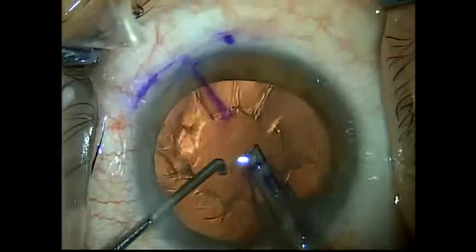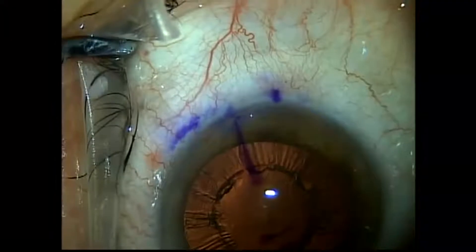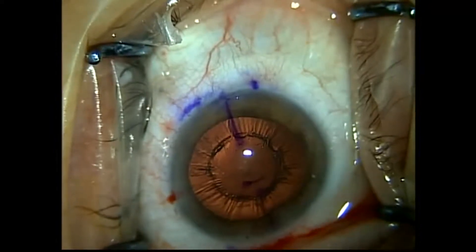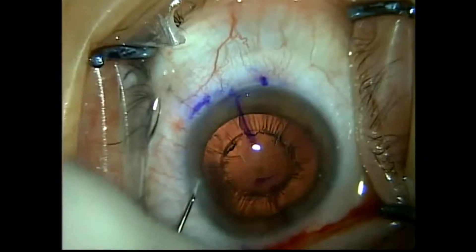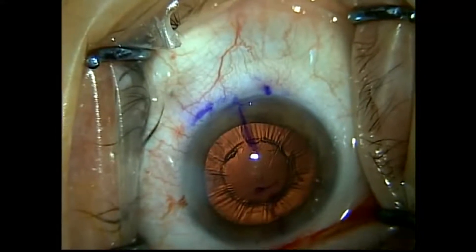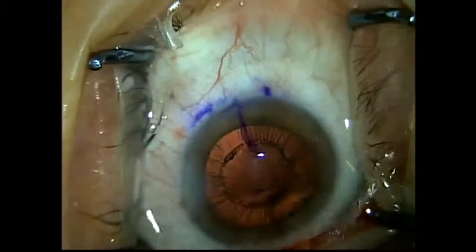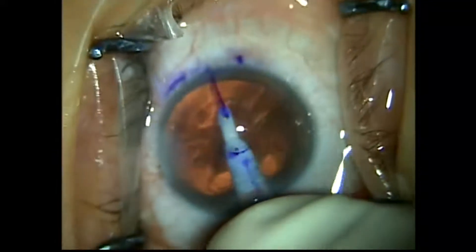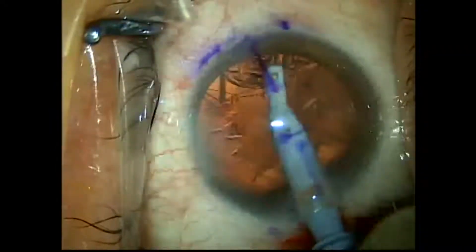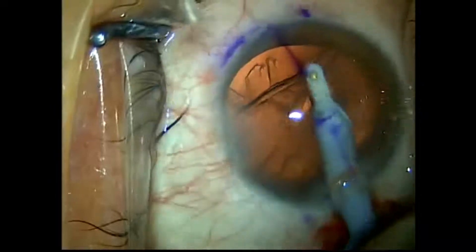I've already emulsified the nucleus and I'm going to begin irrigation and aspiration. To enhance the stability of the anterior chamber, I'll stromal hydrate my paracentesis incision so it's less likely to leak. The patient may feel fluid pressure — be as steady as you can. The pressure may startle them, and they have a little reverse pupillary block which I actually like because it enhances my visualization of the equator of the capsular bag.